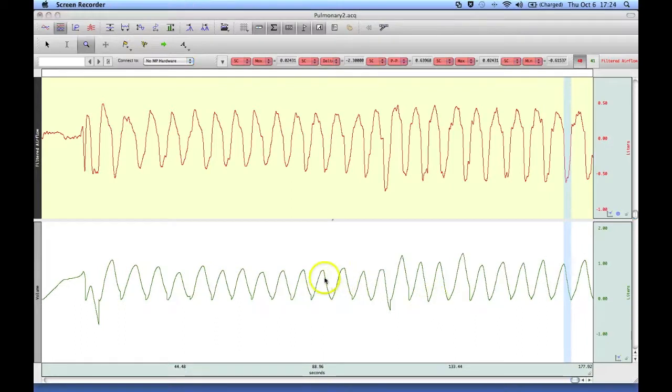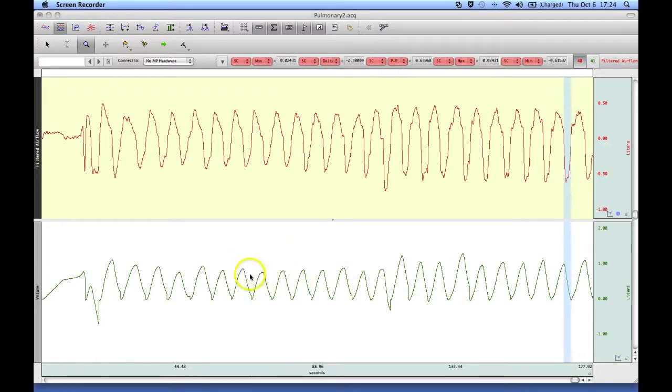And down below we have the integrated flow signal giving us volume.